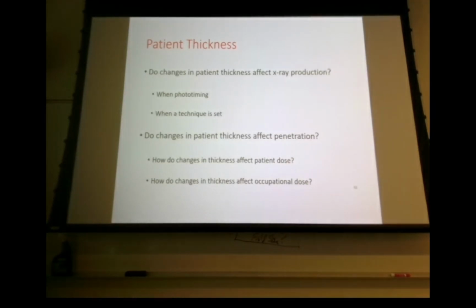X-ray production doesn't really do anything. Do changes of patient thickness affect X-ray production? Providing you haven't changed anything, no. But if you are phototiming, what's going to happen? The phototimer is going to increase your mAs for you, and you're going to have a higher mAs value, right?